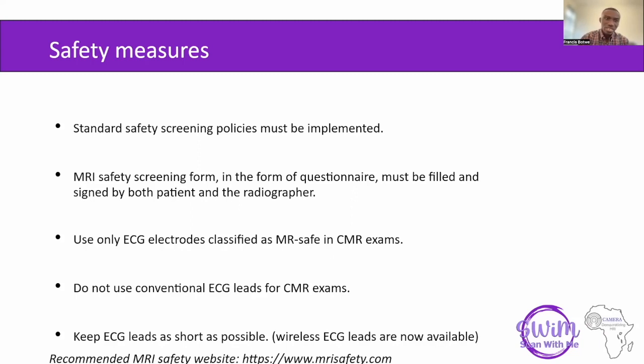There should be a thorough screening form in the form of a questionnaire, and this must be filled and signed by both the patient and the radiographer. When you're going to use ECG electrodes, is it classified as MRI safe to be used in the scanner room?